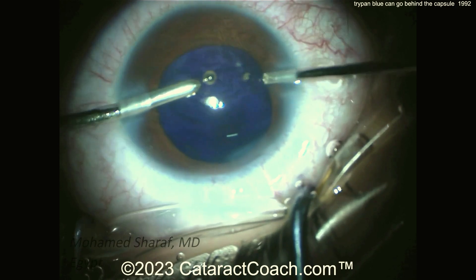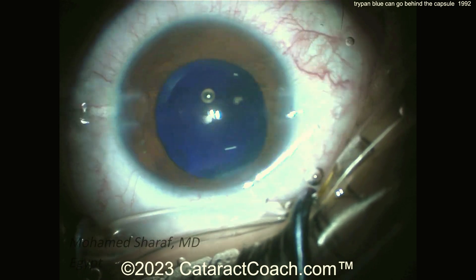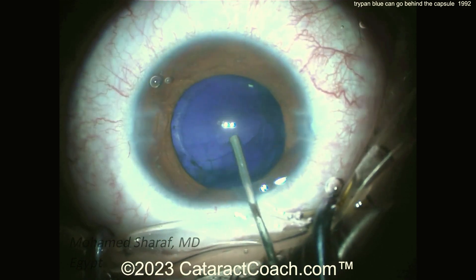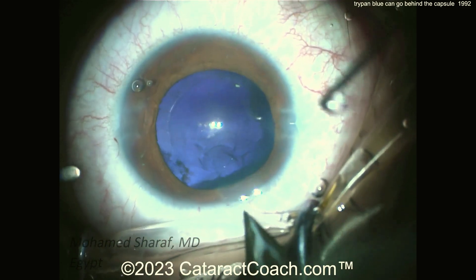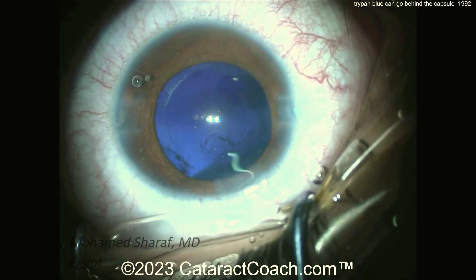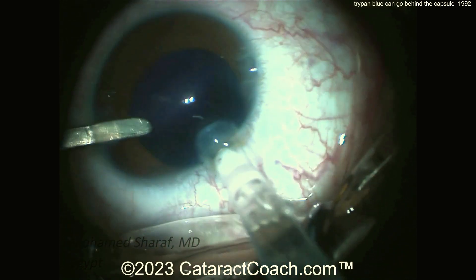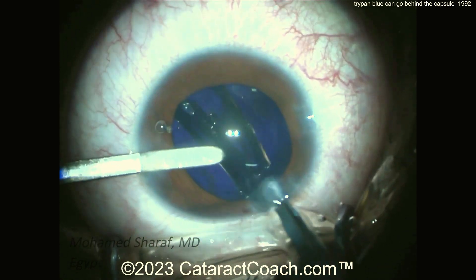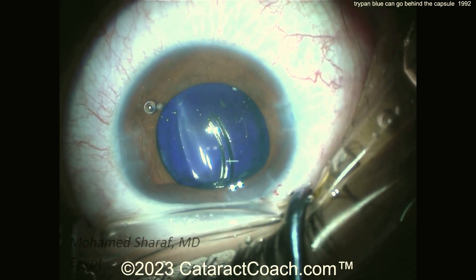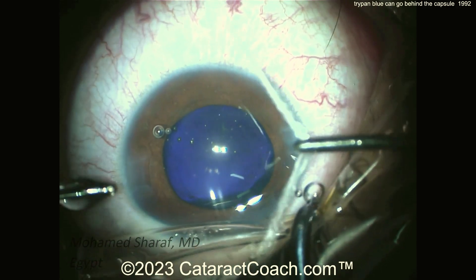Remember the case I had before of the green reflex? It wasn't ICG dye — it was a canine cataract. Look back on CataractCoach.com and search for the word 'canine' to see a veterinary ophthalmologist doing a beautiful canine surgery. Here, slightly enlarging the incision. Given the history of this cataract and the patient being amblyopic in this eye, a monofocal lens is placed in the bag. Wow — pretty small eye. Look how that 6-millimeter optic looks positively large in this eye.